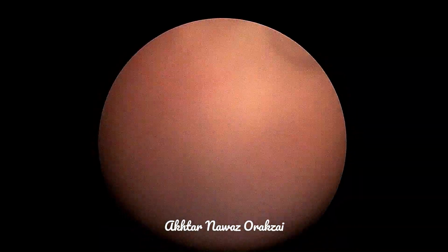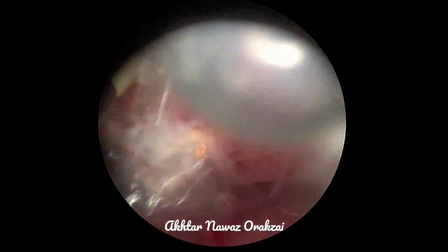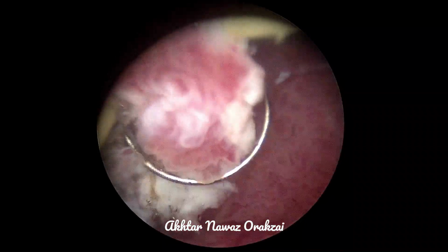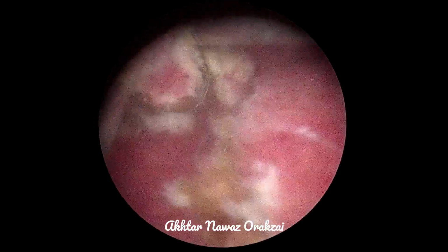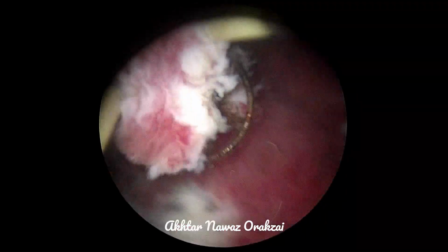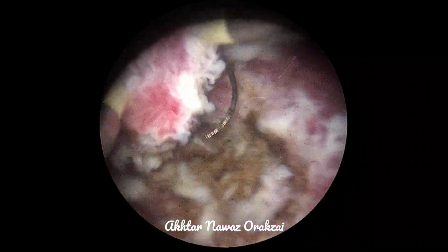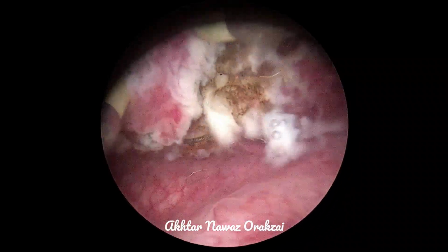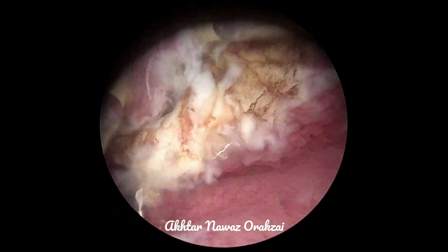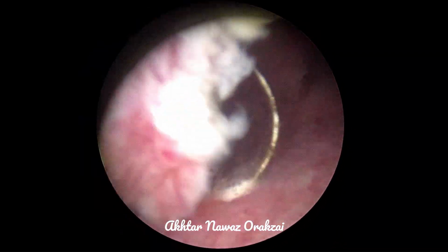This is a patient who had a transurethral resection of the bladder tumor, T1 and low grade, in 2019. He has a recurrence after 5 years. Now he's 24 years old and came with hematuria. On ultrasound, he had two growths of 2 centimeters. So we decided to go for cystoscopy and transurethral resection, and you all saw the findings.